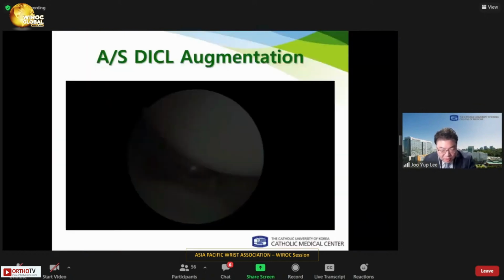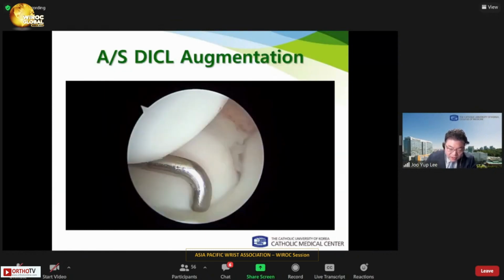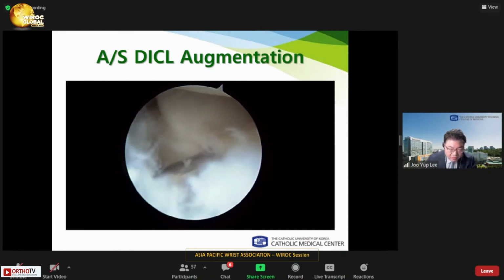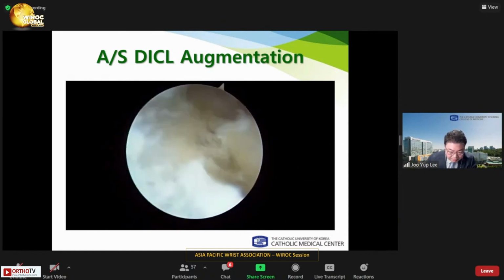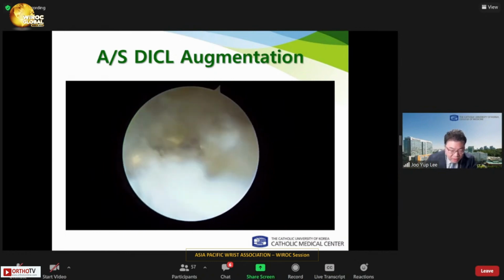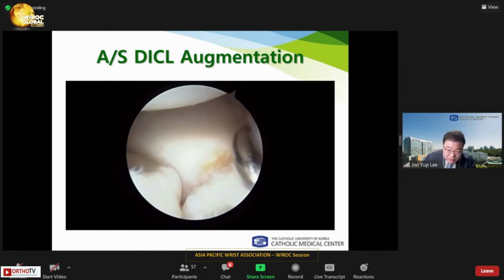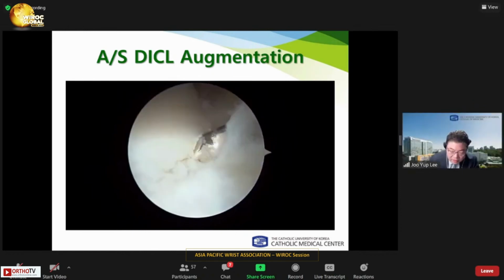Viewing from the MCU portal, routine synovectomy and evaluation of the dorsal scaphotriquetral ligament and scapholunate interval was done via the STT portal. Firstly, a drill hole was made with a blunt tip needle, and a K-wire was introduced through the needle. A cannulated drill bit was used to enlarge the tunnel. After changing the viewing portal, the DST ligament status and lunotriquetral interval were also evaluated.